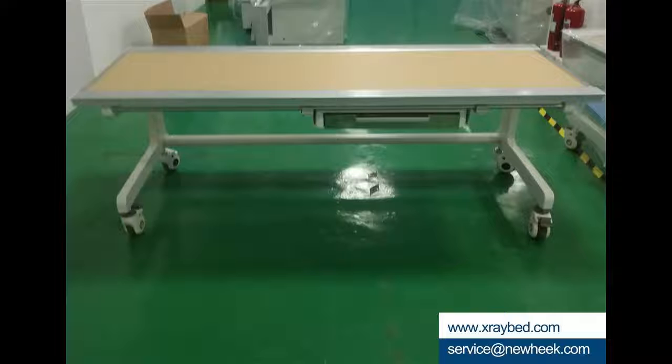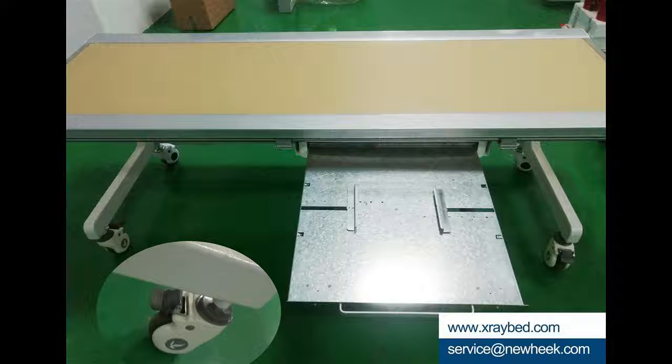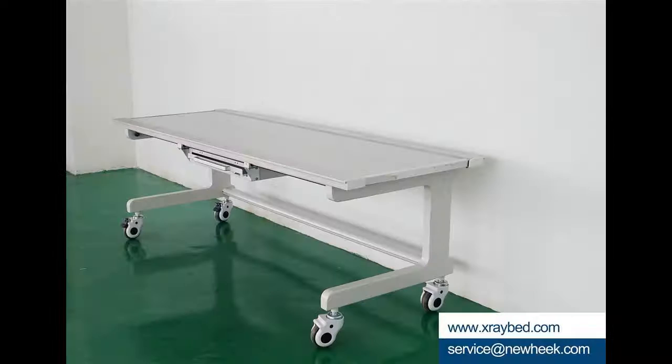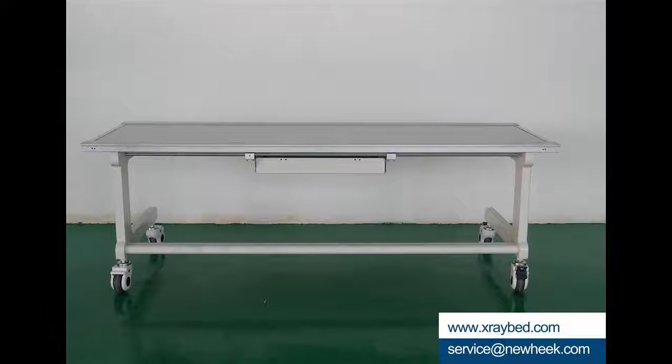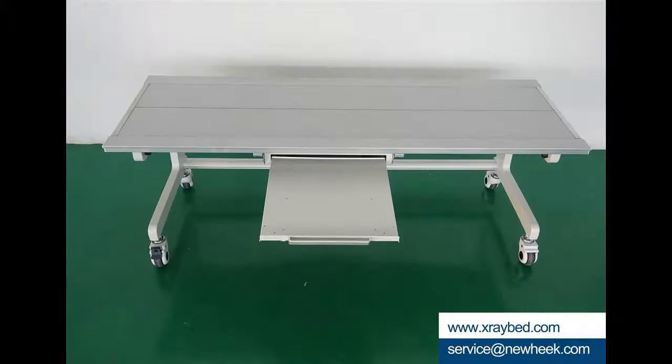At the same time, the X-ray table can be made into two kinds — with and without a Bucky tray — according to customer requirements. The X-ray table without a cartridge can be used in conjunction with the U-arm, and people can easily lie down on it to take X-ray photographs. The X-ray table with a Bucky tray can match with various X-ray machines.